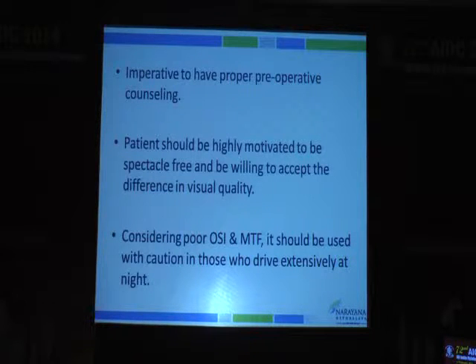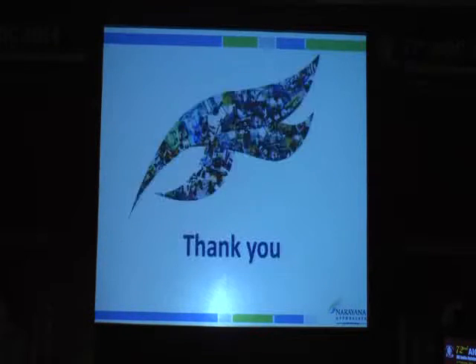And considering the poor objective scatter index and modulation transfer function, it should be used with caution in those who drive extensively at night, but then this would also hold good for people who are considering even primary multifocal IOLs. Thank you.